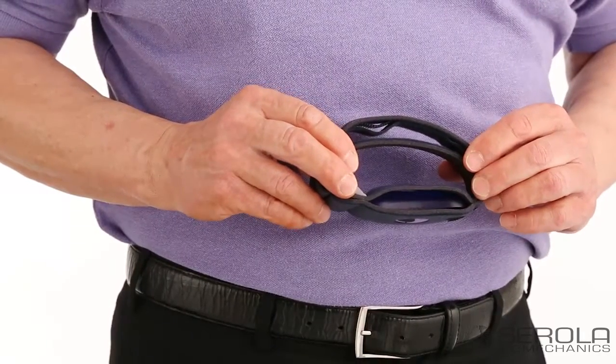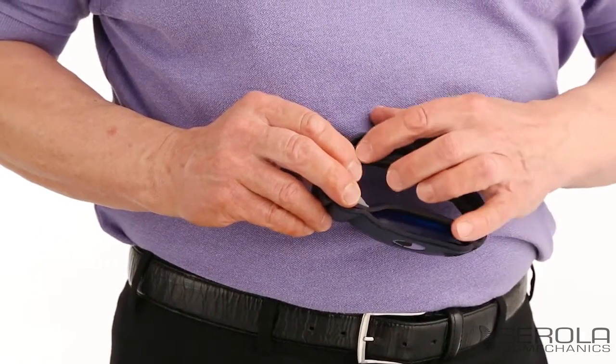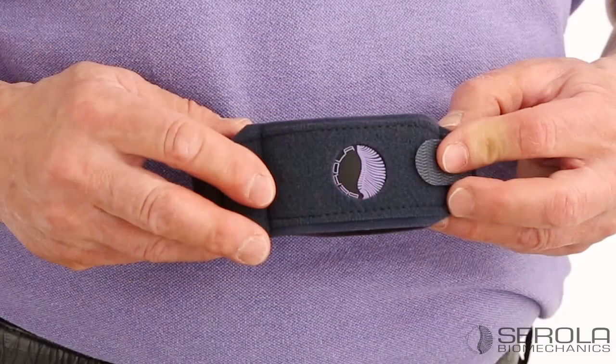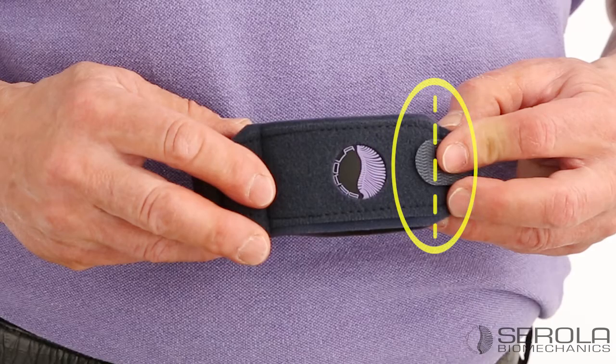The Serola GelArc elbow brace has a patented shortening system that makes it a one-size-fits-all brace. Shortening is recommended when the end tab overlaps the stitching, as seen in the photo.